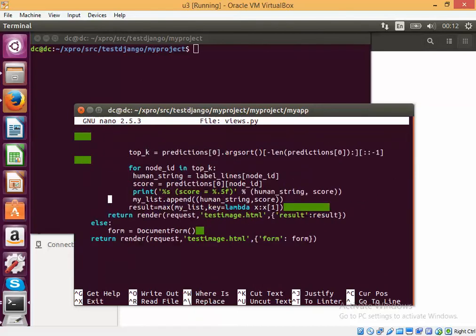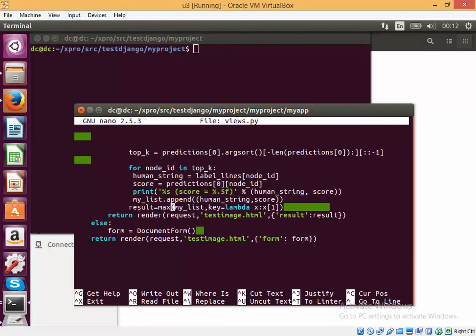After we get the prediction we will save the prediction into a list. And in the list we will do a max. So the max will actually find the probability which is maximum between the two classes or any number of classes that are there. It will find the class which has the highest probability and it will send it back as a result.